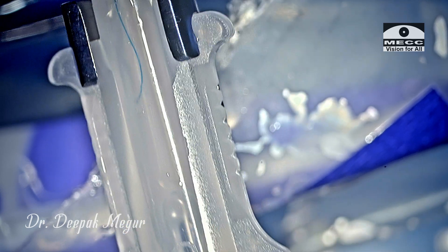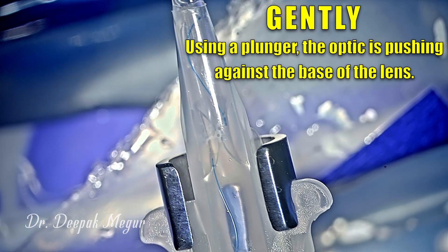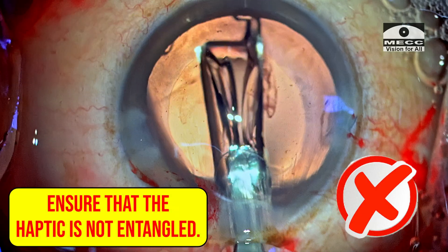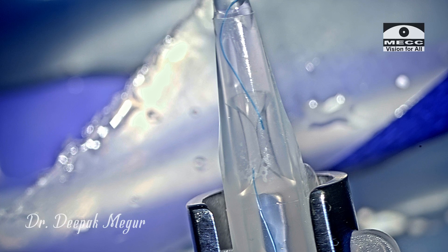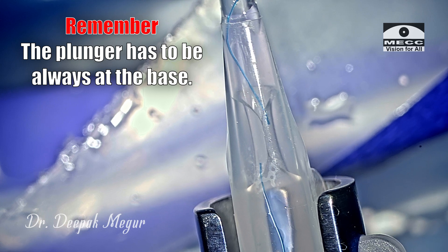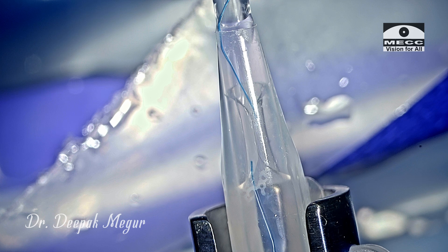With the plunger, the optic is gently pushed. Point to note: the plunger has to be pushing against the back side of the lens, and on rare occasions there is a risk of the plunger overriding the optic. We should be mindful that this is not happening. Remember that the plunger has to always be at the base, and once we're certain it is not overriding the optic, we can proceed.